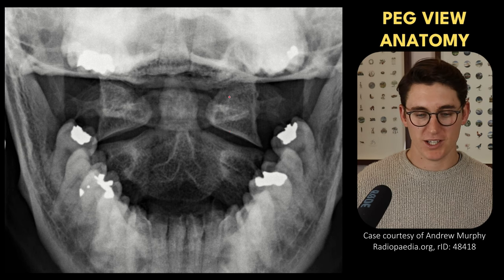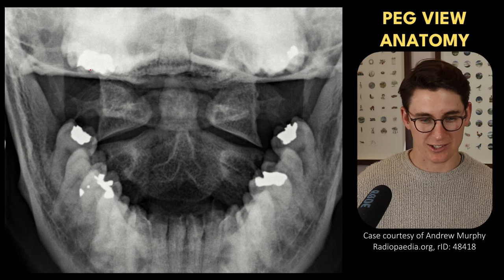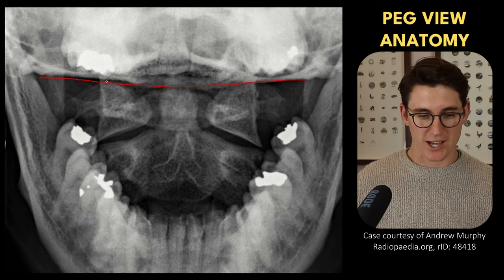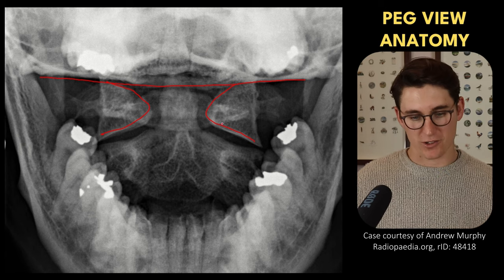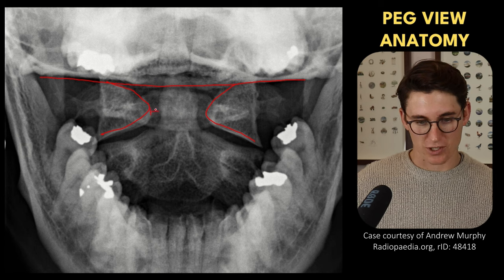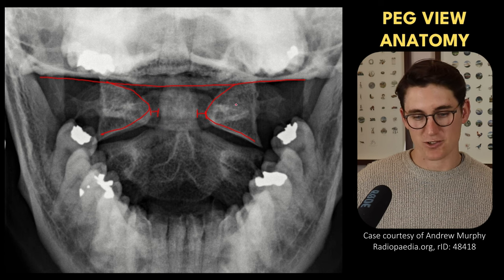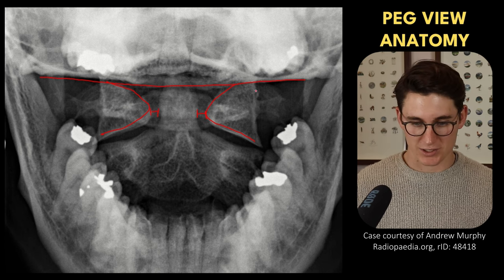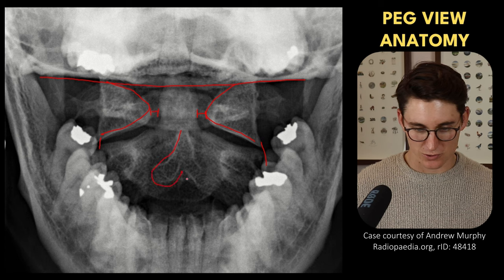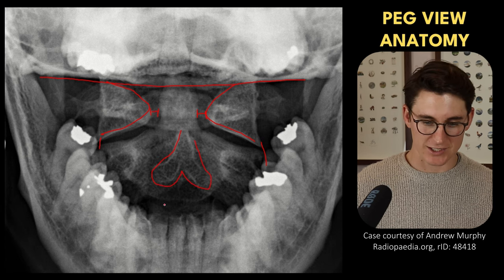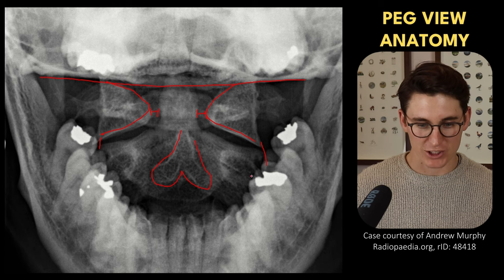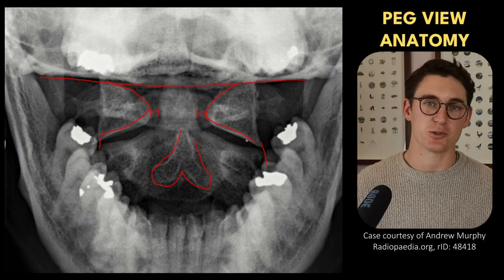Our last view is the peg view or open mouth view. We first check it's technically sound by seeing that the teeth line up with the occipital bone — that tells us we have a good view into C1, which wraps around the odontoid process. We want to see that the space between the dens and the lateral bodies of C1 is equal on both sides, and that the lateral bodies of C1 match up to the lateral bodies of C2. The C2 spinous process is also bifid. This open mouth view is primarily to establish the relationship between C1 and C2 and ensure there are no fractures in those bones.